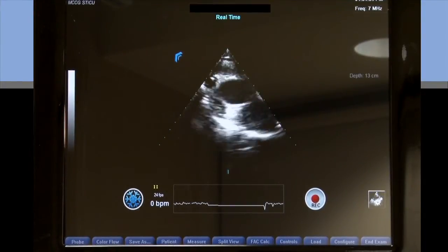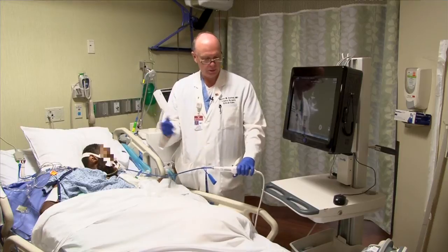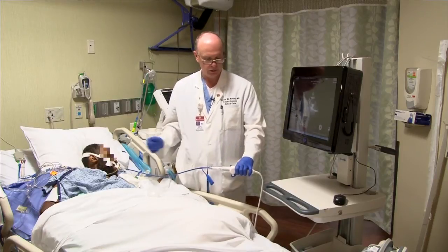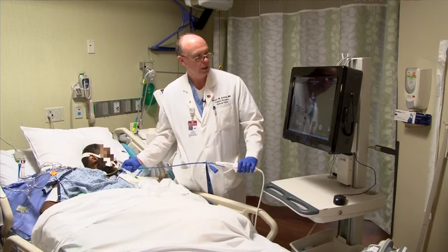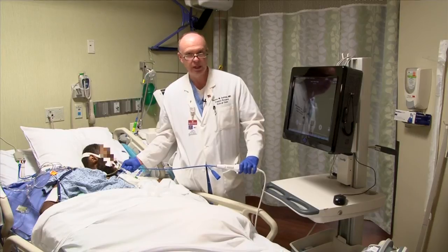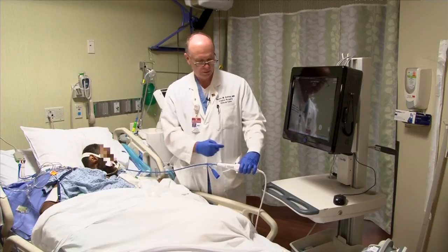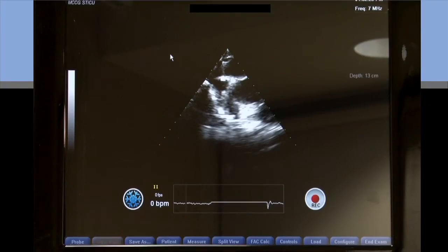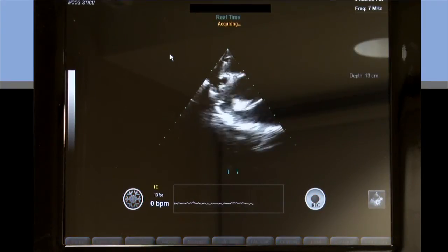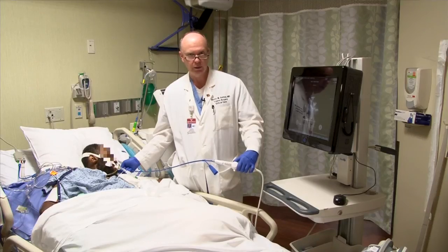I can also tap it to the other side to swing the image back to midline, so I have two ways of doing that: I can do it with my probe using my right hand and the handle with my left hand, rotating clockwise or counterclockwise. I have good position here with the SVC and the central line in the middle of the SVC. I'm going to depress the acquisition button on the handle, which will give me a loop to save to my disk. We want to do that at least two or three times to make sure I get a good run and have choices when I look back through the loops and pick the best loop.